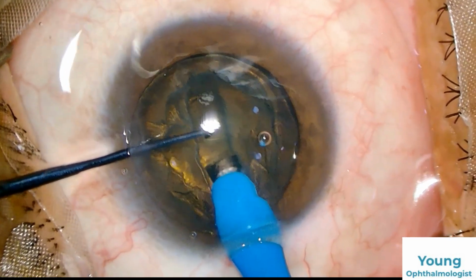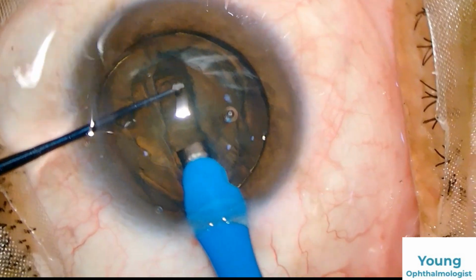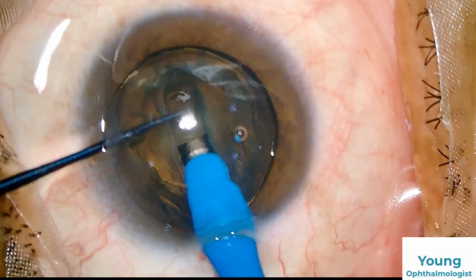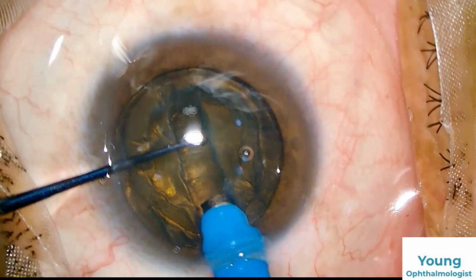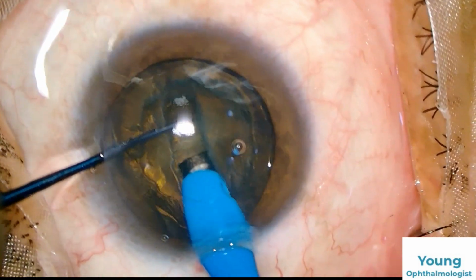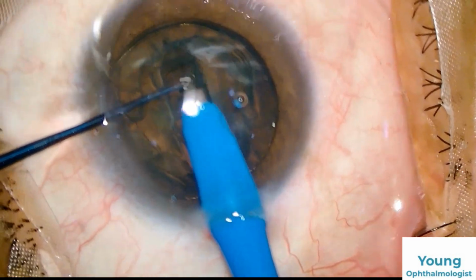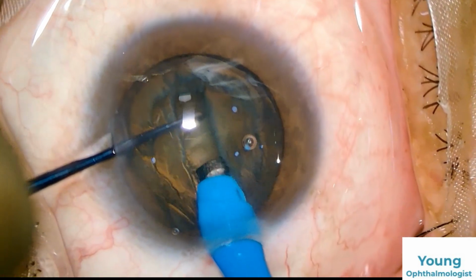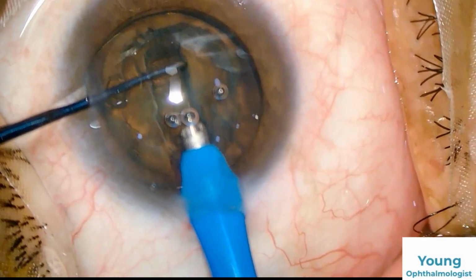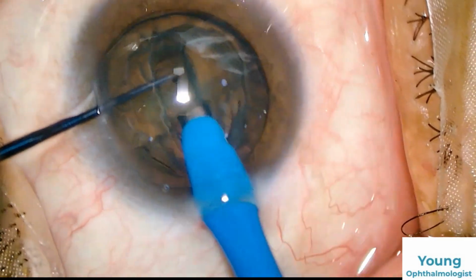A good trench is formed end to end, deeper in the center. In a soft cataract, you have to be careful while making the trench, and the power calibration should be proper, because sudden emulsification of the nucleus in the center can cause a rent also if you go deep and apply more power. Any air bubble coming in the view should be aspirated.